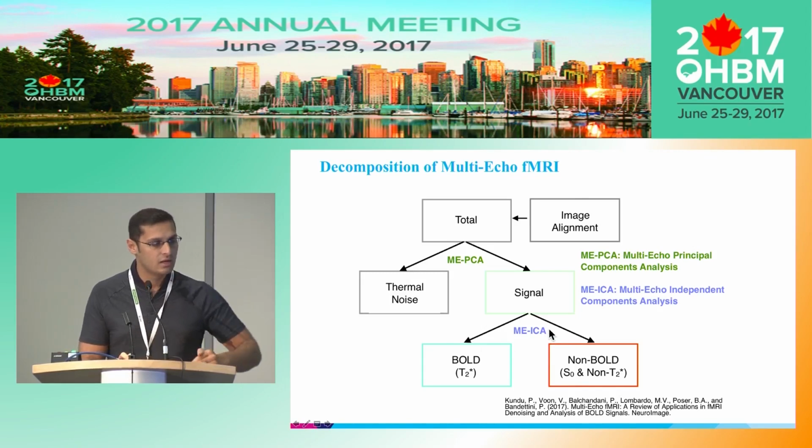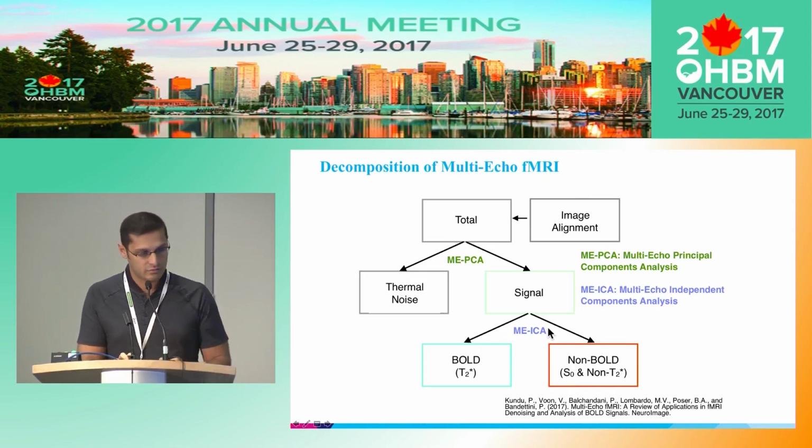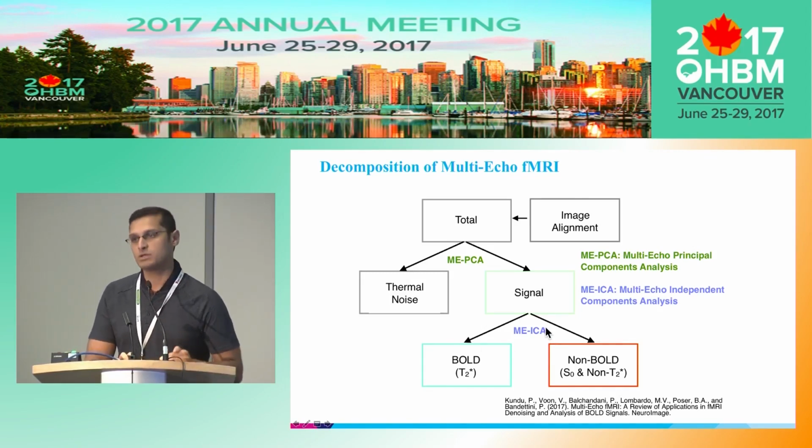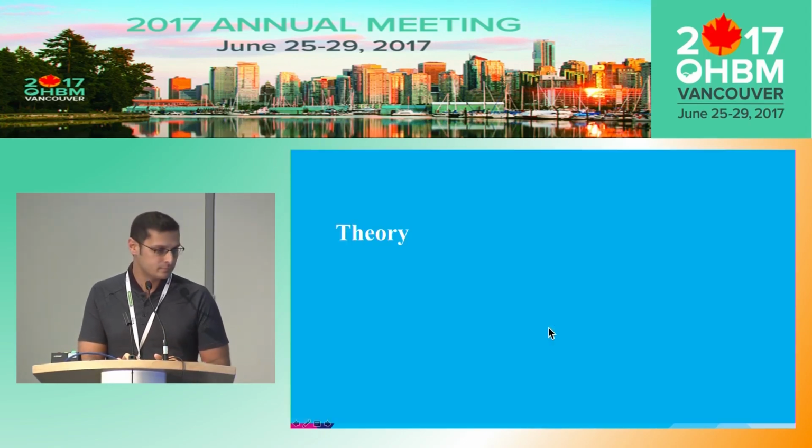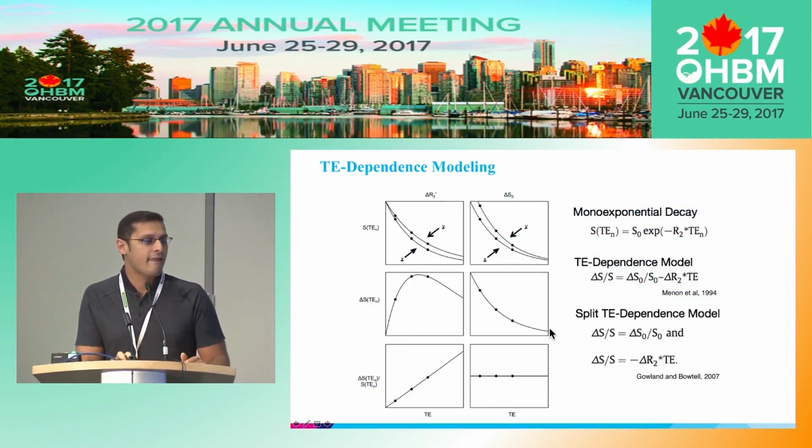And the goal of multi-echo fMRI analyses, at least as we've put it together, is to essentially explain as much of the variance as possible and attribute some aspect of a model to it. So just a little bit of theory.